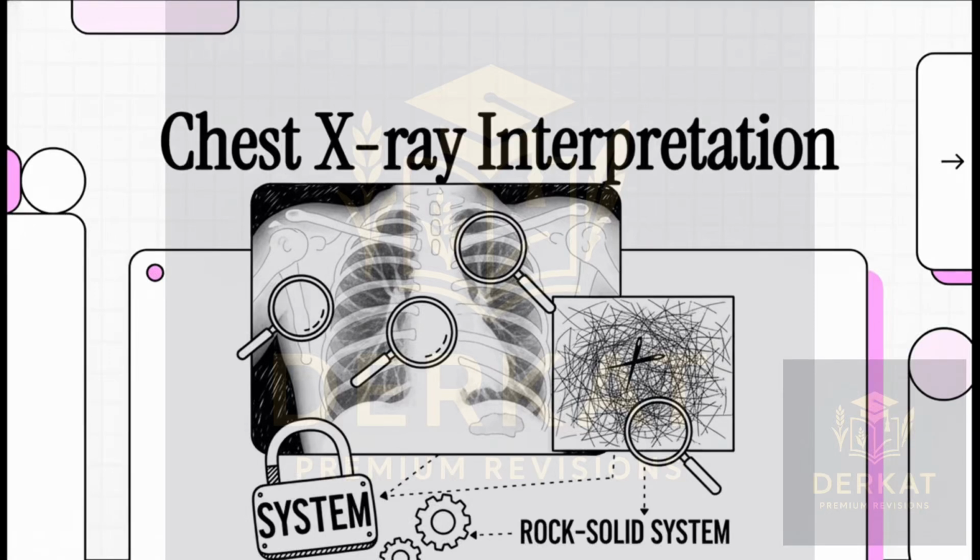Everyone, and welcome. If you're a medical student, you definitely know that feeling, that moment of dread when a chest x-ray gets slapped in front of you during an OSCE. It can honestly feel like you're searching for a needle in a haystack. But you know what? It doesn't have to be that way. In this explainer, we're going to build a completely rock-solid, systematic approach that will let you tackle any chest x-ray with total confidence, especially when the pressure is on.